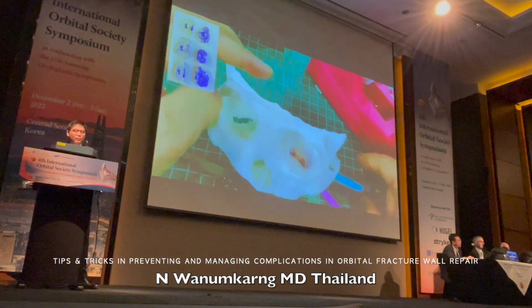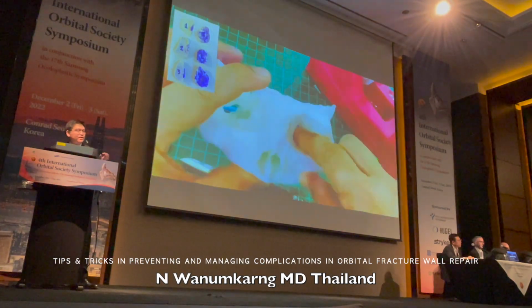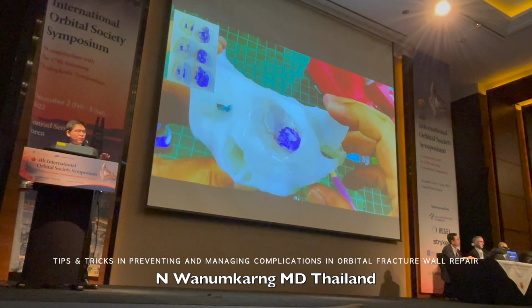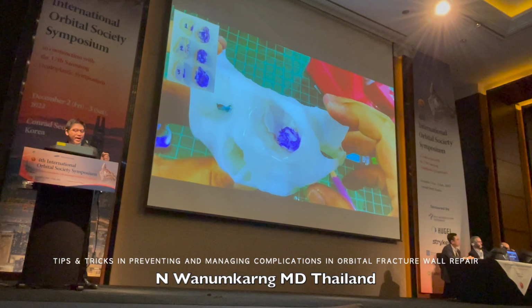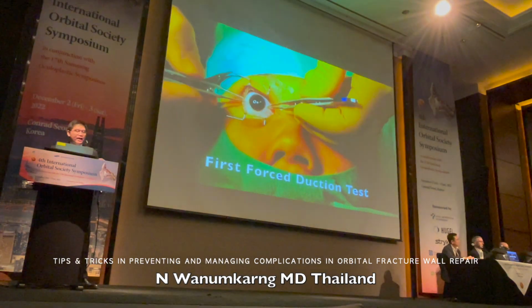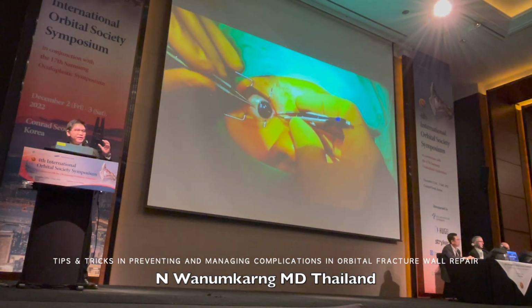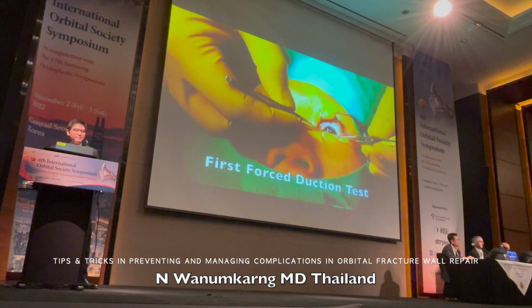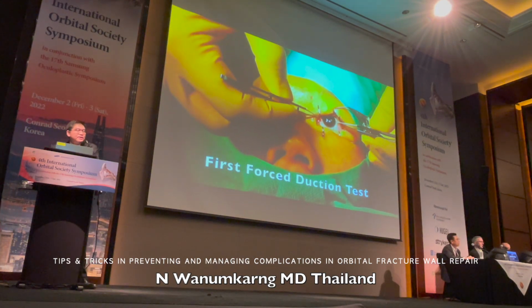So in this case, we got the 3D model, and I used Scotch tape to cover the floor because there is no soft tissue at all. Then I put the hard air-drying tray on that one and let it dry, and then we sent the template to the company. The company used a digital scanner, and we got the implant the next day. So when we go to the surgery, the force duction test is very important.